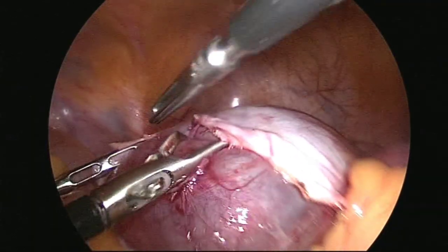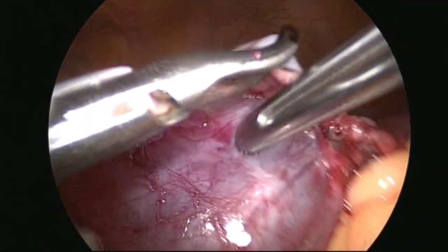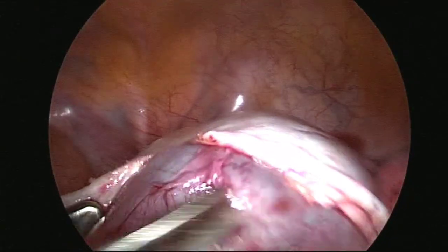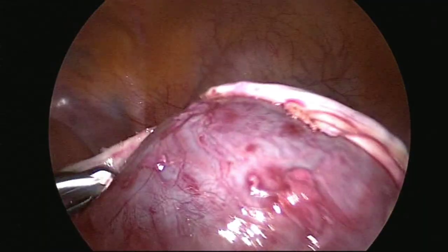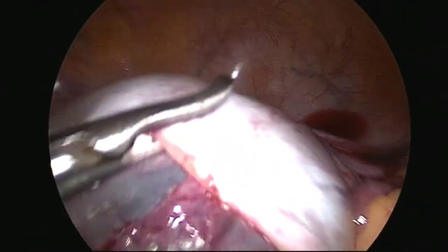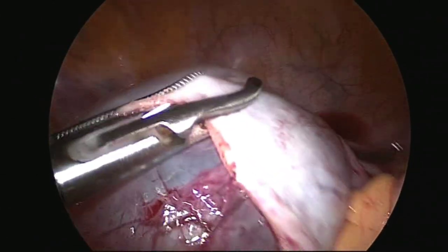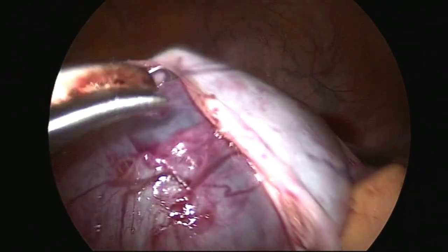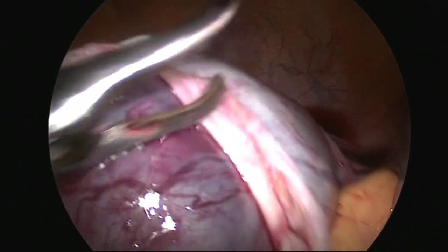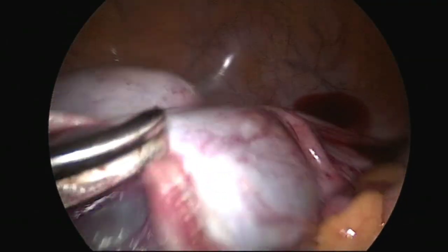My assistant is trying to hold one side. Now I'll cut this part also.